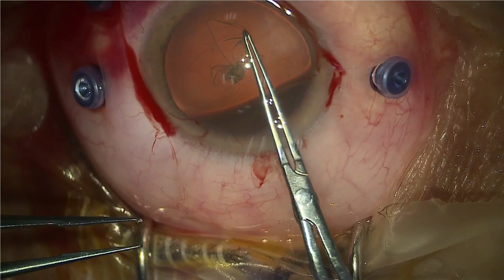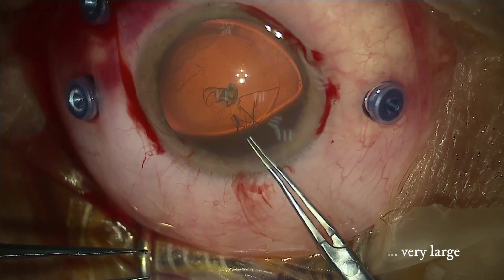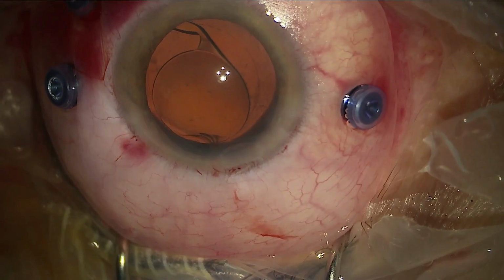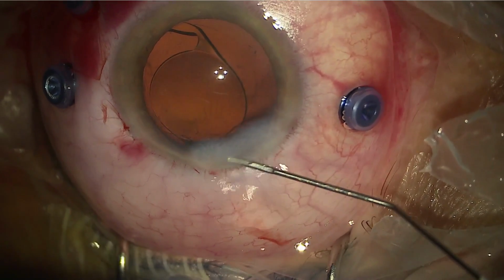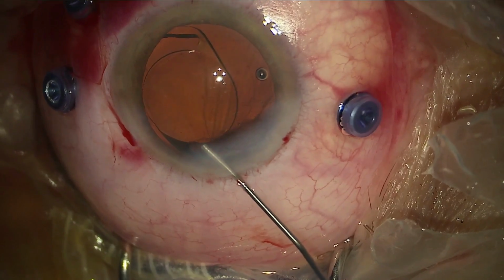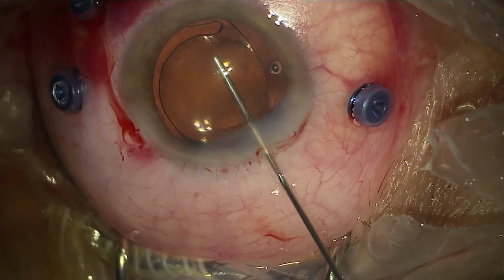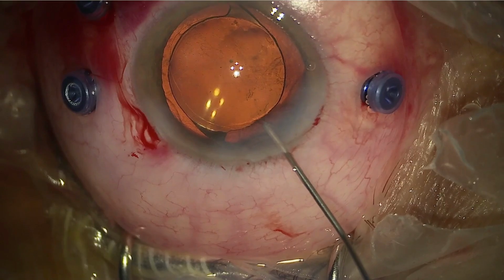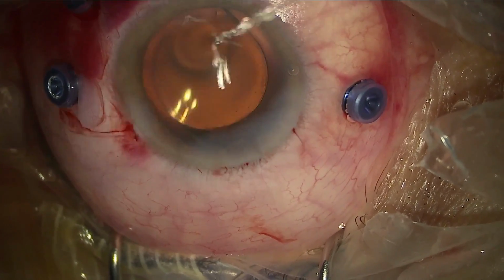So you can see the rhexis. It is actually very large compared to the usual rhexis I do in combined procedures. The IOL tends to luxate in the anterior chamber, and I have to use injection of BSS and especially injections of viscoelastic to keep the IOL in place in the bag. This is the injection of viscoelastic to push back the IOL in the bag.